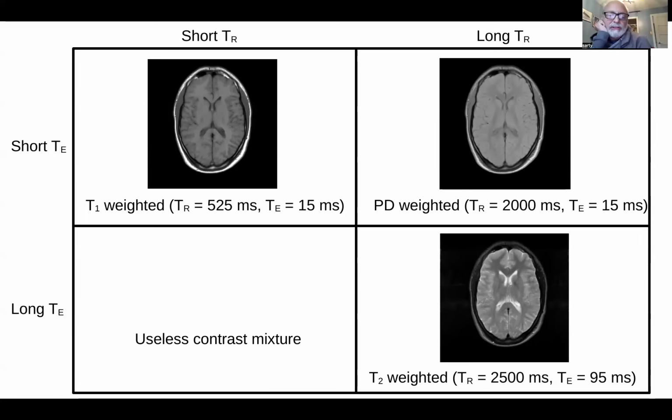Okay, so what you're talking about is gadolinium contrast that's injected into a patient. And what that does, if I got this right, is it changes the T1 relaxation time of some of the tissues. So this is just your basic brain the way it is, and if you inject that contrast, it will change the T1 of some tissues.